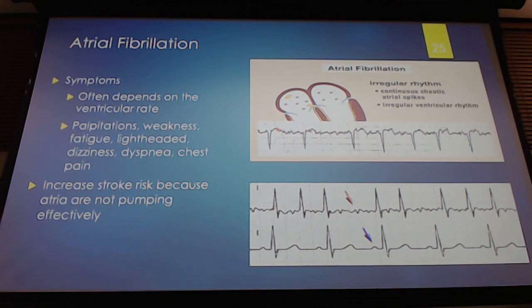But you don't really see anything. There's a whole bunch of lines in there. And then you will have a depolarization at the ventricles. But look, irregular conduction of that depolarization from the atrial foci down to the ventricles. And not only is it irregular, but it's irregularly irregular. Okay? And that's what we commonly say about atrial fibrillation. It's irregularly irregular. It makes no sense to me how these depolarizations are occurring.